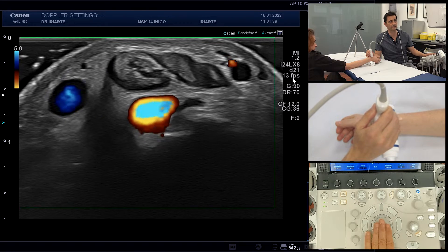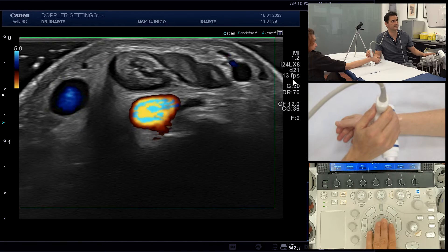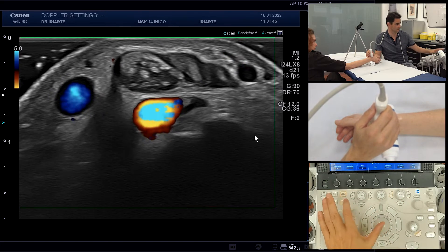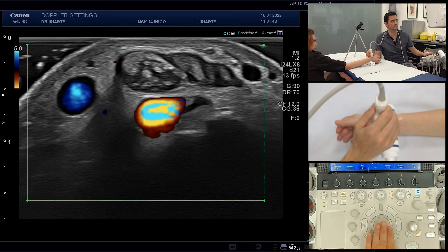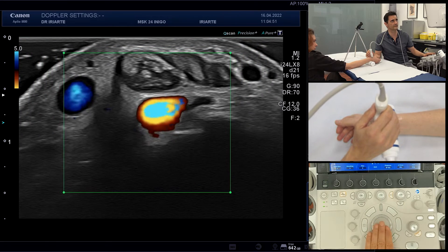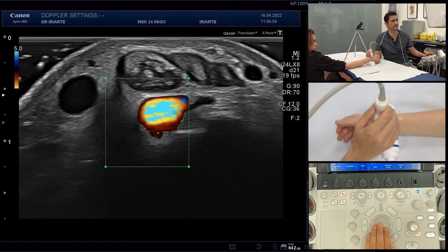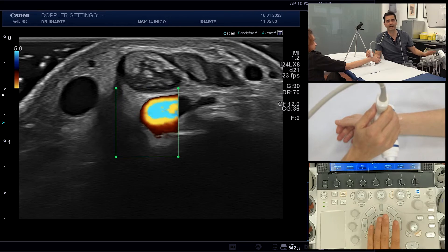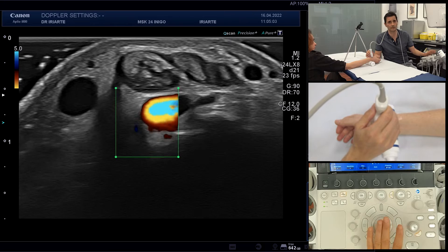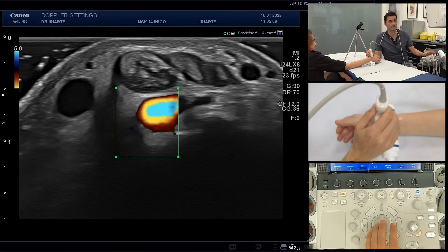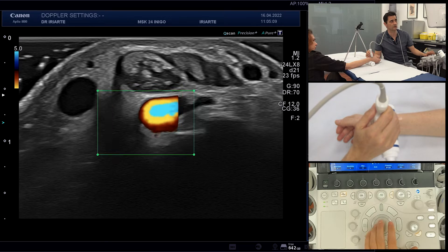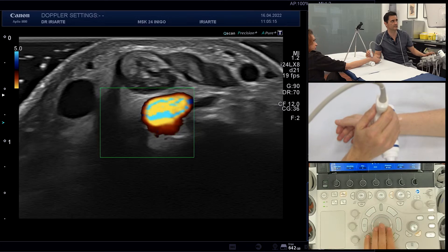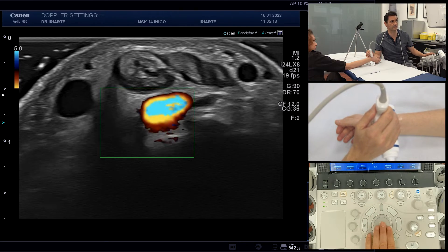With a huge Doppler box we see 13 frames per second, and as the Doppler box becomes smaller, you see the frames increasing — 16, 19, and 23 frames per second. So the ideal Doppler box must be just the size you want to analyze and no more, because we can only see the flow inside the box.